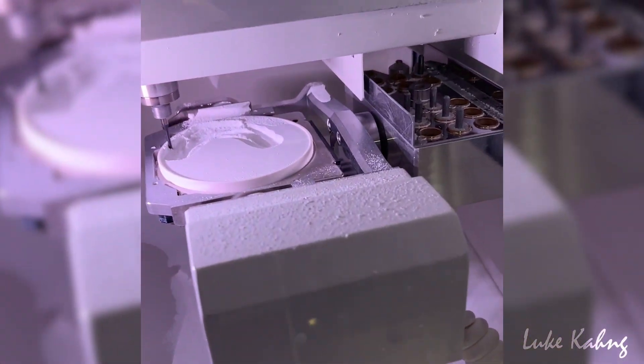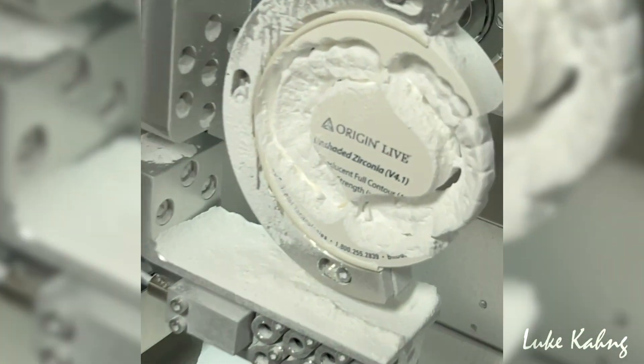We then send the design files to our milling machines, which proceed to mill out the arches in zirconia.